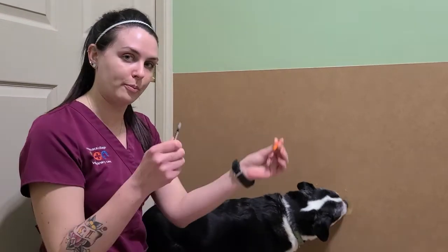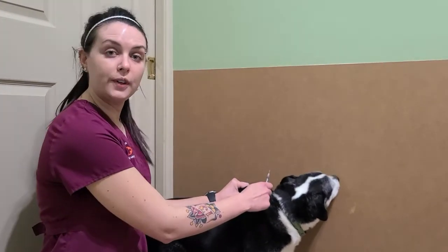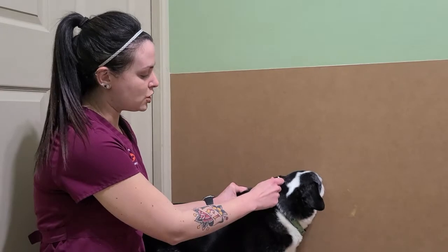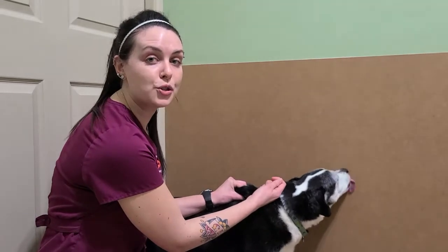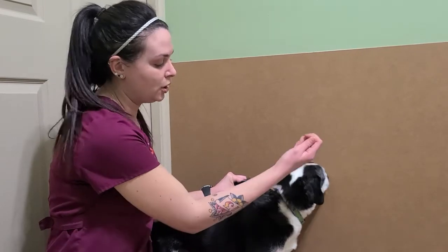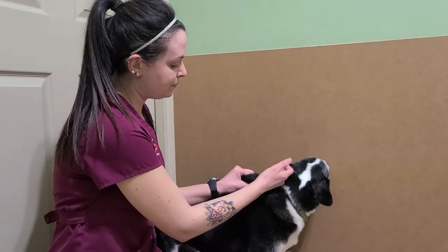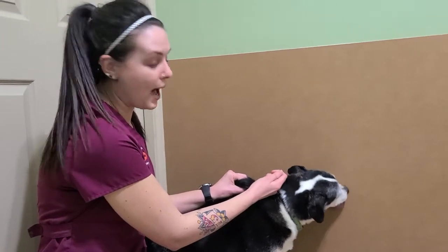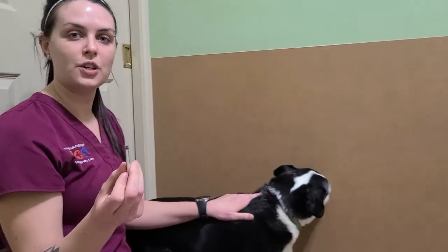I'm going to go ahead and take off my cap, make my little tent — I usually feel it beforehand. We're going to inject, and you're going to pull out your plunger. You're going to make sure there's no blood coming into your syringe; that just means that you're in a blood vessel. If you do see it, go ahead and pull out, and then you can go ahead and poke again. Pull out — I see only bubbles. Inject. There's our injection.